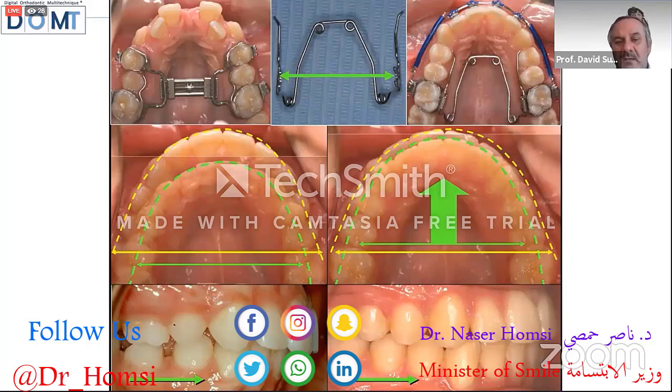For example, in the maxillary problems, I always recommend starting treatment with maxillary expansion. Why? Because we need to unlock the malocclusion. We need to unlock the mandible and move the mandible forward. And for this reason, the first step is to put a quad helix or something to produce expansion. And next, the use of a utility arch to control the anterior guide.